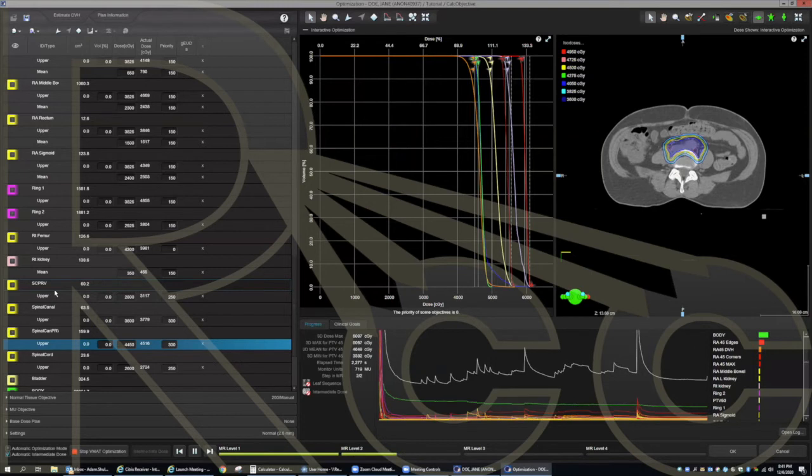Yeah. So like you said, it depends on the physician, it depends on the patient too. I got to the point at my last center where I trained all my physicists and dosimetrists in this method of planning, and the organs at risk were getting so low that we would have doctors in some cases add an extra fraction or two. And they would say, we're getting no complications.